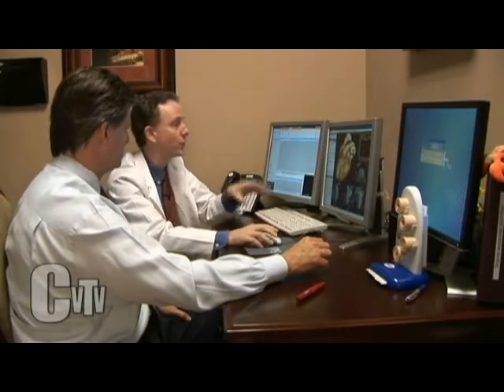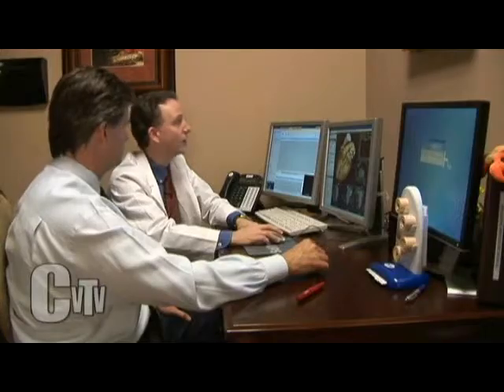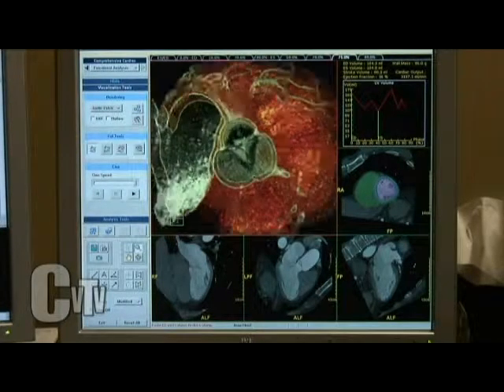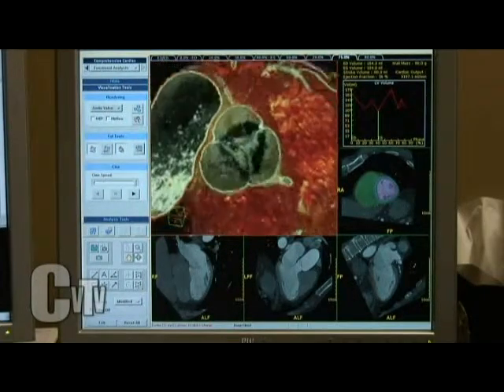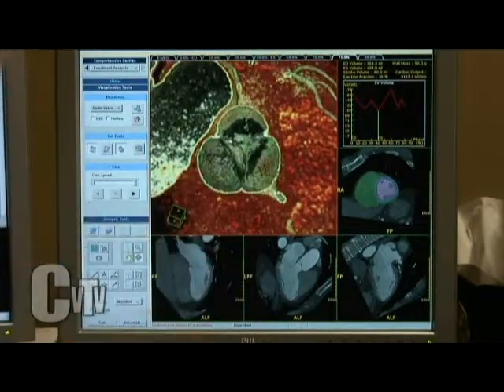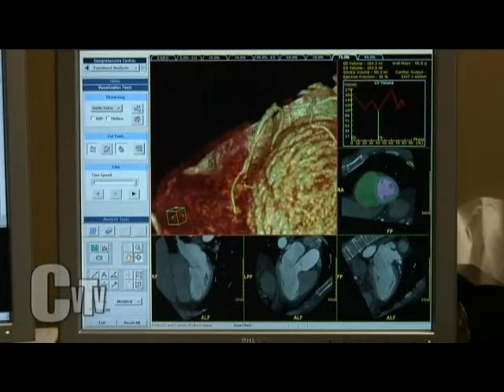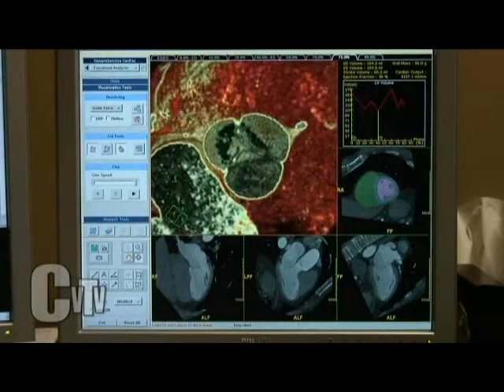Amazing. Remember, we get 3-dimensional volumetric information about the heart, so because we have the data, we can also look inside the heart. So we can look at the valves. This is the aortic valve, one of the major valves of the heart, so we can make sure the heart valves are normal as well. This is the aortic valve right here. It has 3 leaflets or cusps, 1, 2, 3. I can turn, spin, and rotate that around. So there's the aortic valve right there. This is the inside of that valve.